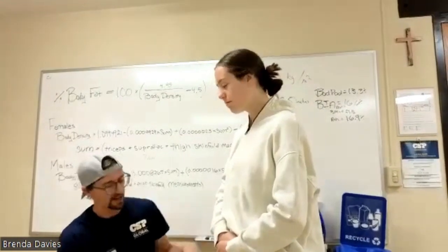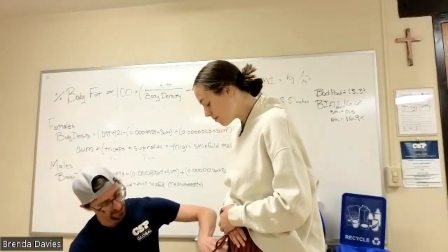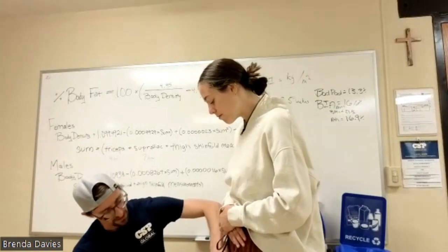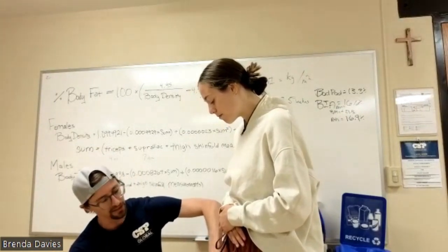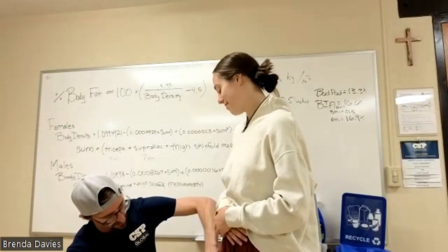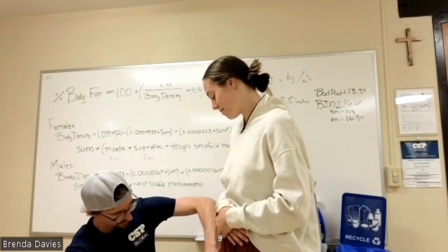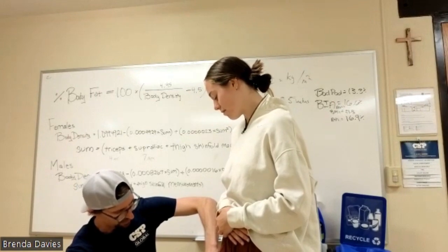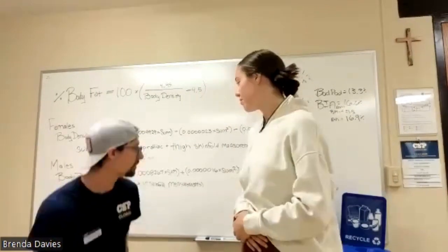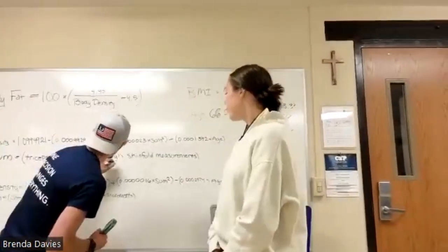So then I'm going to have you go halfway in between the kneecap and kind of that bend in the hip. And okay, can I have you flex? Okay. Sorry, this one kind of hurts. It kind of hurt. Yeah. So then I'm going to subtract 1, so you're at 29. So I'm going to be at 28 for that because again we had that extra layer of clothing.